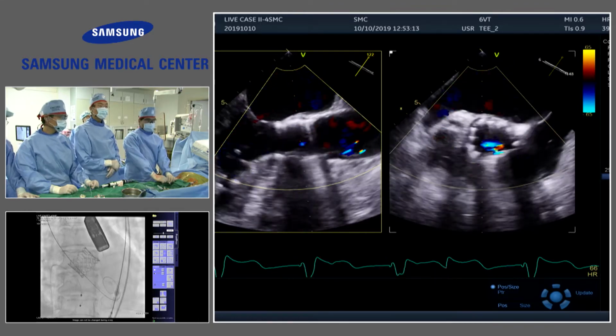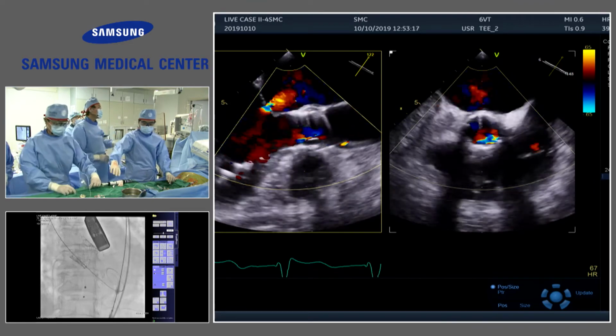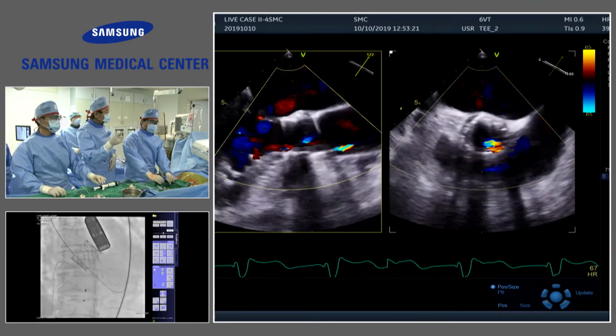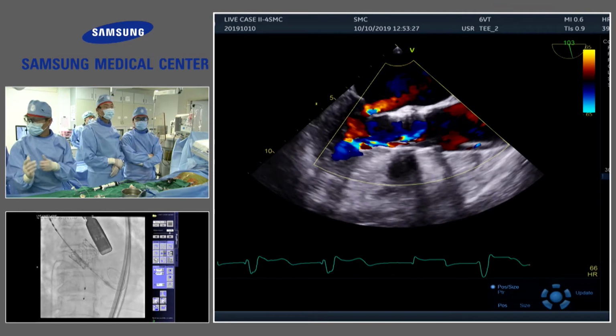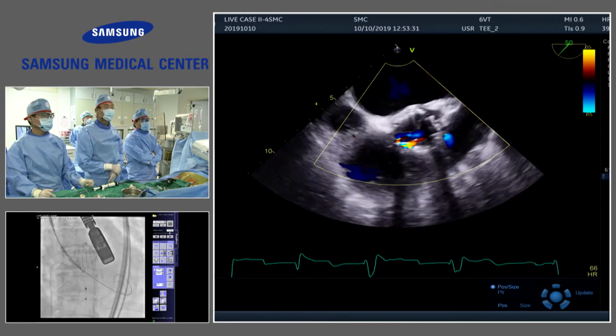Personally, I don't go for post dilatation because the frame is occupying quite a lot at the annular level. I totally agree, the measurement is only 19. Definitely here is a good job, but maybe I'm a little bit conservative. It improved a little bit; there were two jets of AR.